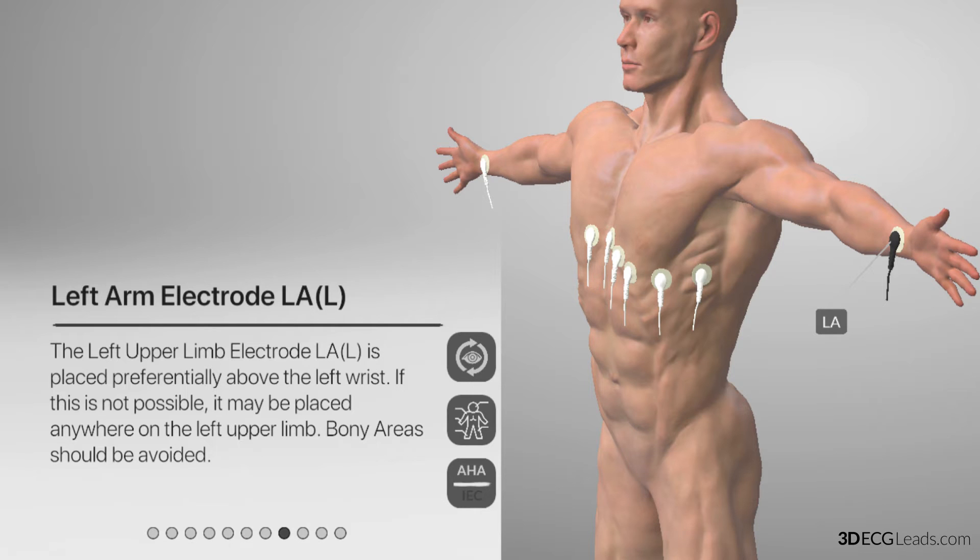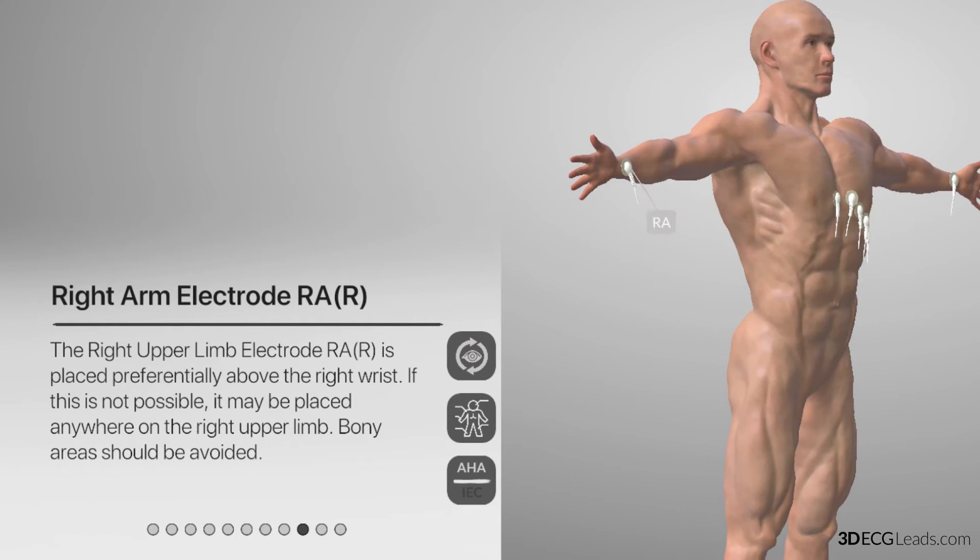Moving over to the right arm lead, it is named RA, and is white in color, and should be placed slightly above the right wrist.